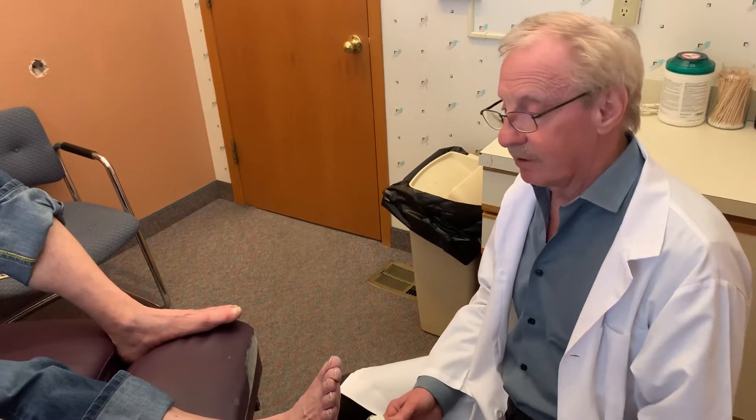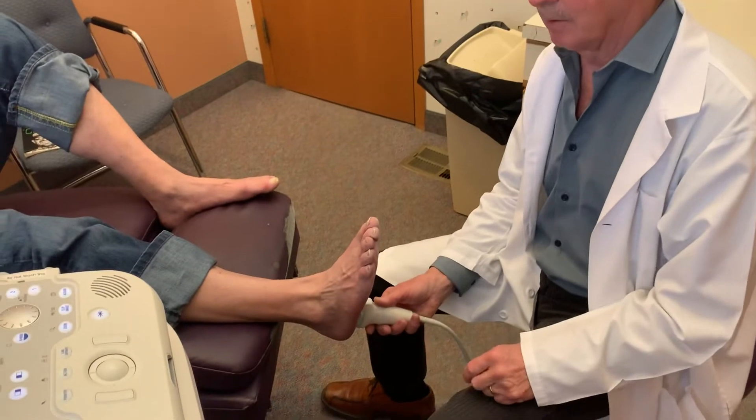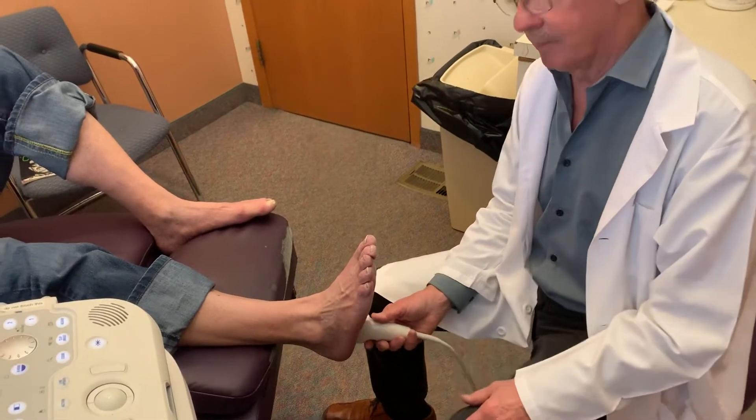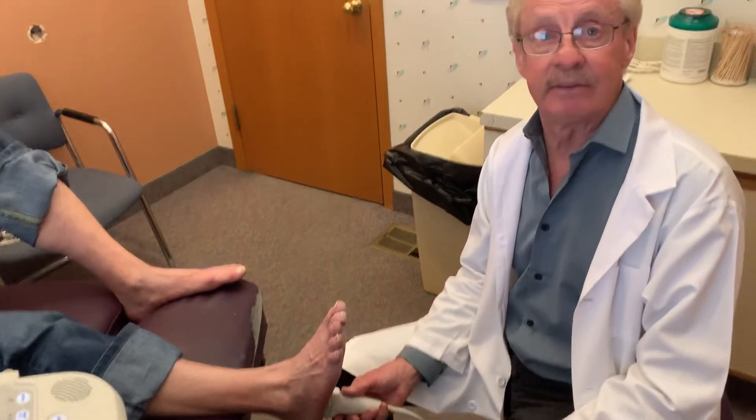Because most people come in, their fascia is going to be pretty thick — thicker than it should be — which is about a four millimeter thickness where the fascia attaches to the heel. So, for instance, if it's maybe eight millimeters thick and we do our Regenerative Medicine treatment, it'll sometimes go down from eight to seven, or eight to six.